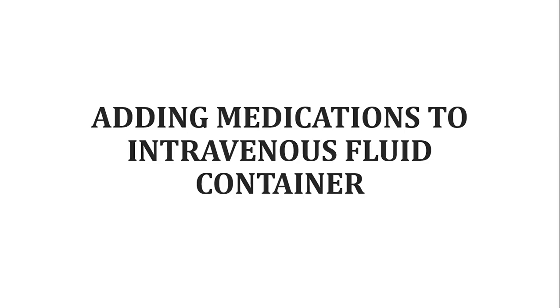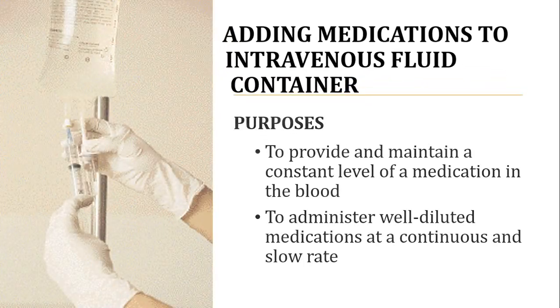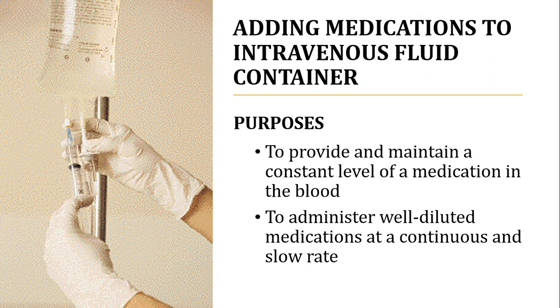First one is adding medications to intravenous fluid container. Adding medications to intravenous fluid container is intended to provide and maintain a constant level of a medication in the blood, and to administer well-diluted medications at a continuous and slow rate. It is the safest and easiest way to administer a drug intravenously because the medication is first diluted in an intravenous fluid before it is administered to the client.